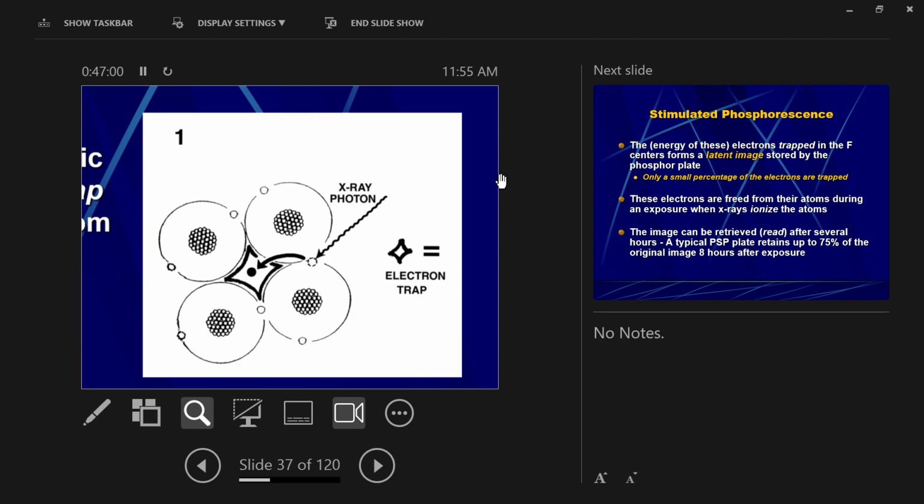Energy continues to be converted, okay? So let's go back to X-rays. X-rays are a form of energy. So the X-rays strike this plate and all their energy gets deposited into the plate, okay? The phosphor material on here is able to capture the X-ray energy and store it as a form of potential energy, energy of position, okay?